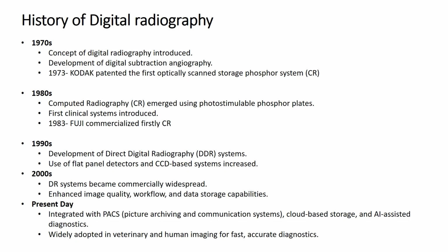So the evolution of digital radiography started in the 1970s. In the 1970s, the concept of digital radiography was introduced, and the development of digital subtraction angiography was also started.